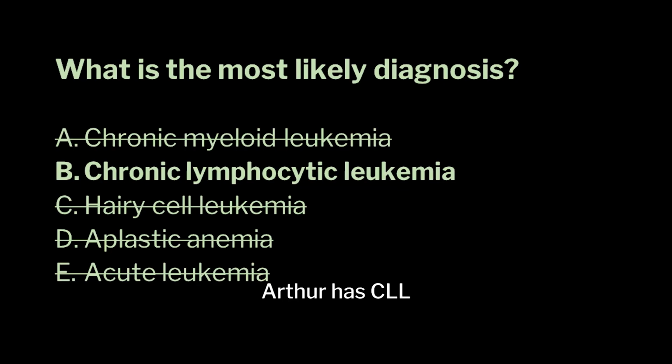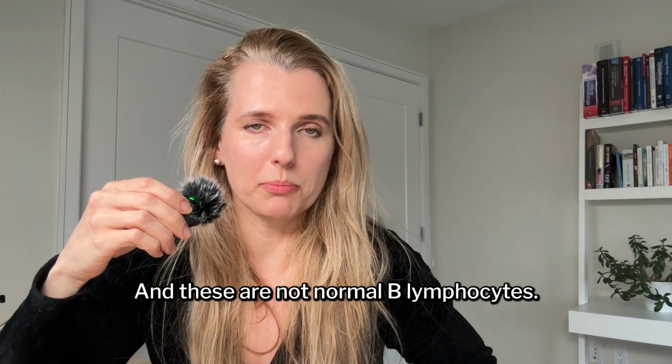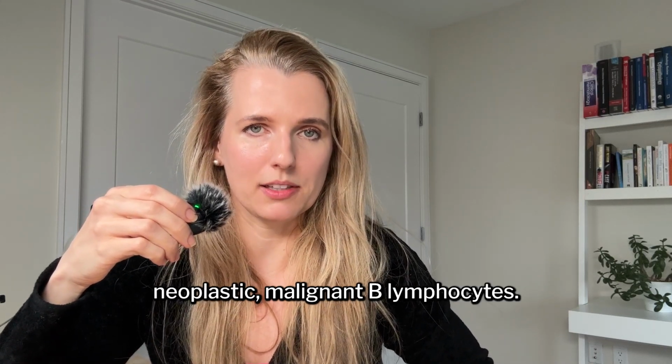Arthur has CLL, where his blood has way too many B lymphocytes in it, and these are not normal B lymphocytes. These are atypical, neoplastic, malignant B lymphocytes.